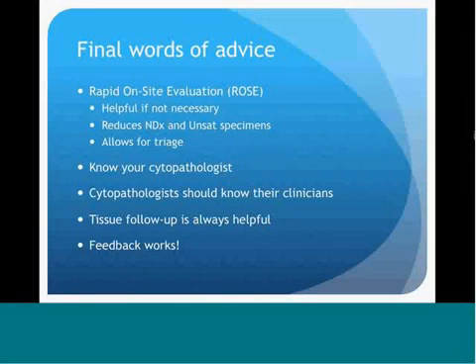It's not necessary, but it is very helpful. This will reduce the non-diagnostic and unsatisfactory specimens, as well as offering suggestions for triage of specimens, such as molecular testing, immunohistochemical studies, or ancillary testing like flow cytometry.